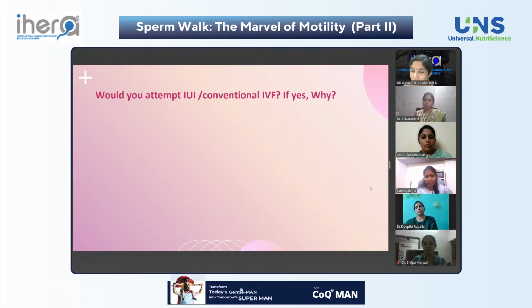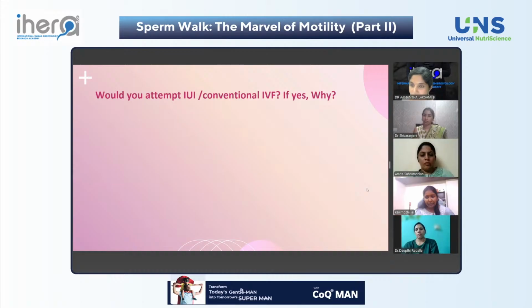So we have to train our juniors to see this. Whenever we are doing motility assessment on a glass slide, that is the best way, because when we check the spermatozoa at 40x, we can at least make out the morphology of motile spermatozoa, which we don't get otherwise until we are doing ICSI. So while doing analysis, it is a very important part. We have many patients in whom morphology is very low. So we prepare a wet slide and see at 400x to 600x what the morphology of motile spermatozoa is. That is the advantage of doing motility on a glass slide. Yes, sir, definitely, I agree with you.